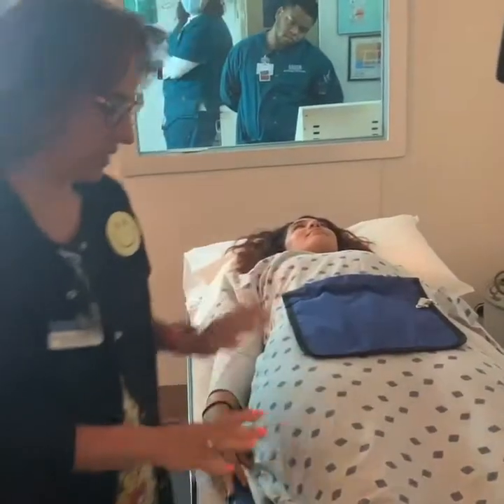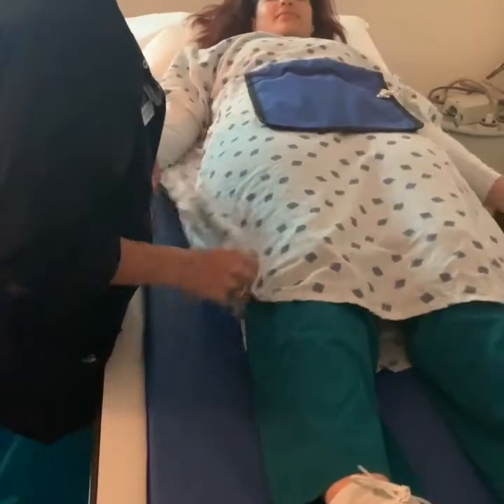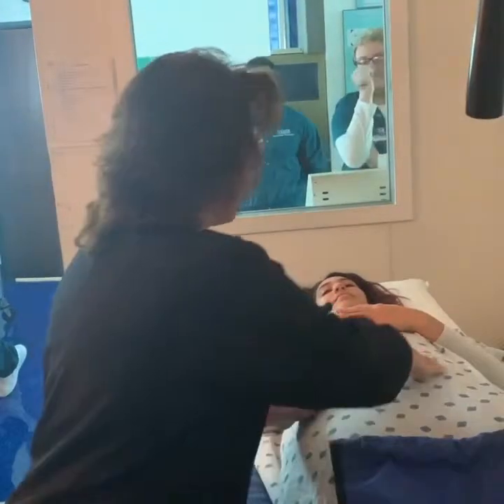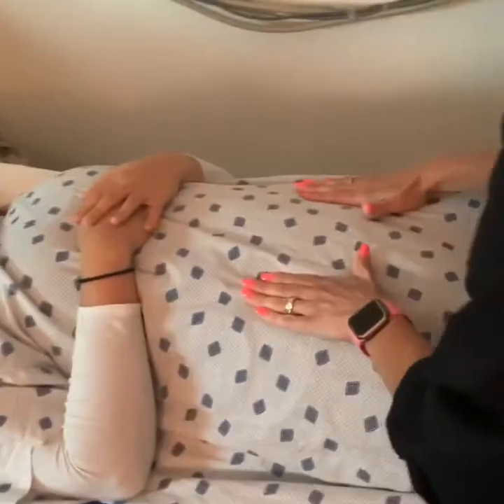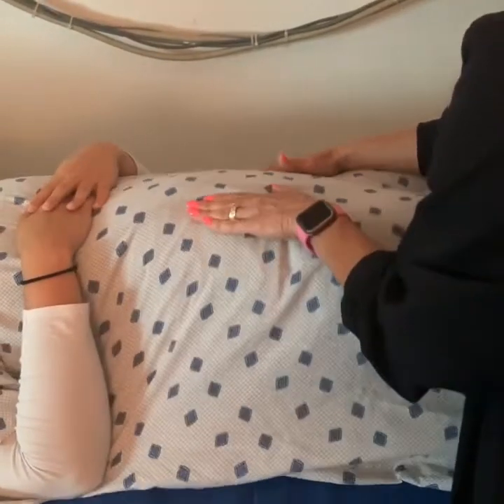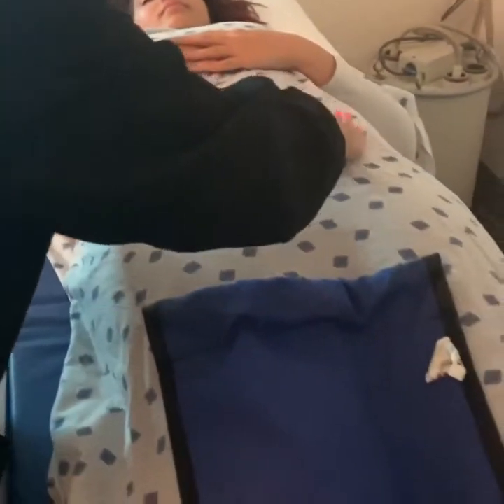All right, and what we'll do, you said it's your right femur, correct? I'm just gonna have you scoot to the left for me just a little bit. Good. Now, one of the things that we talk about with pelvis and with femur and with hip is making sure that they lay flat on the table. Most patients will lay flat, but how you can check that is you find both ASISes and you make sure that your hands are about the same height. Roll for me one way or the other. If she rolls, notice my hands change. They're not in the same parallel plane. Roll the other way. Good. Roll back. So when she's laying flat, both ASISes should be equidistant from the tabletop. Does that make sense? So they're both flat.